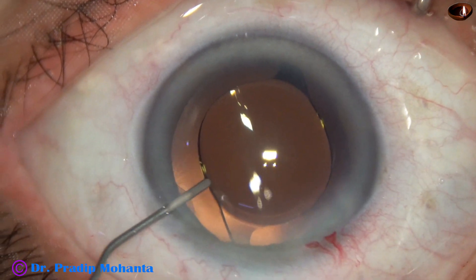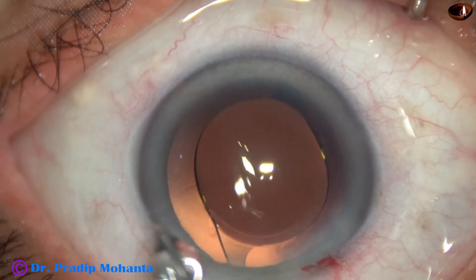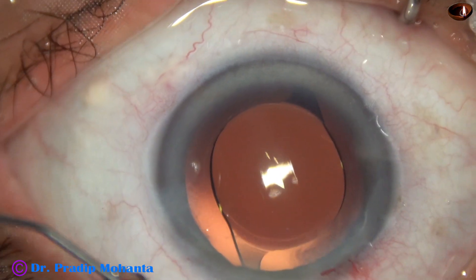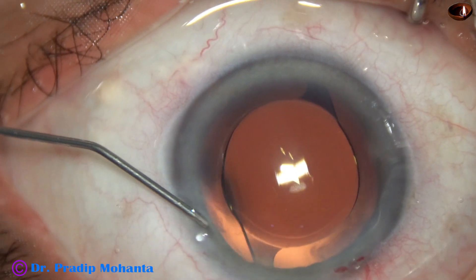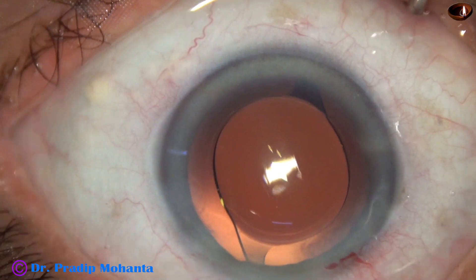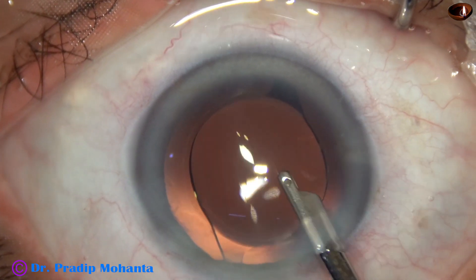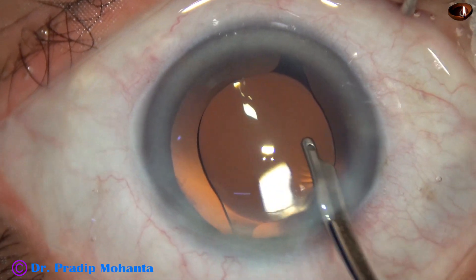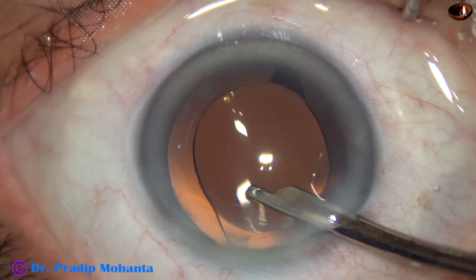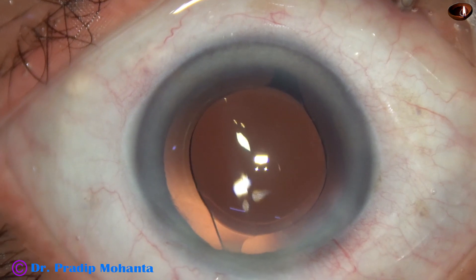This is a bit of moxifloxacin. Now the side port is hydrated — corneal stroma on either side of the side port is hydrated for closure of this stab incision. Now a final lavage of the anterior chamber. At this time, any visco remaining and sticking to the posterior capsule is removed. The wound attachment is nicely formed and the case is concluded.